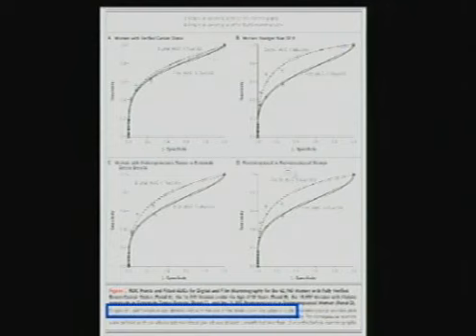But look at these three curves, which are the women younger than 50, the dense or heterogeneously dense breast tissue, and the pre or perimenopausal. They look almost identical. That's interesting. Now let's look at the analysis that's more familiar to us.